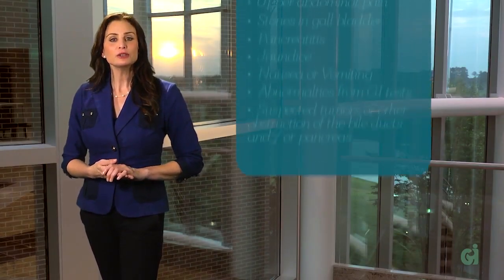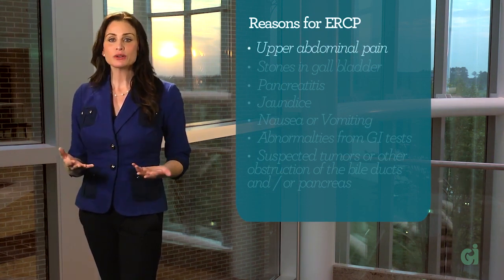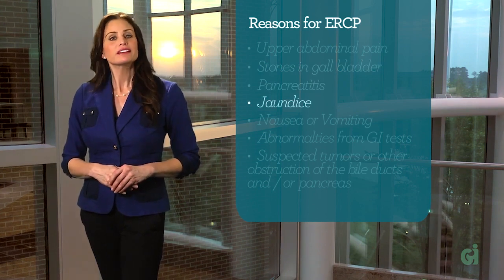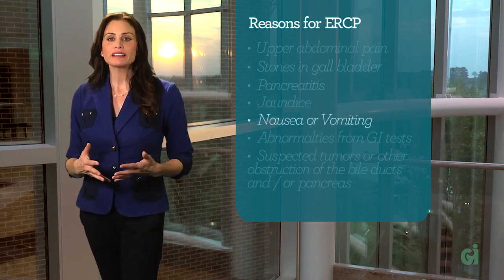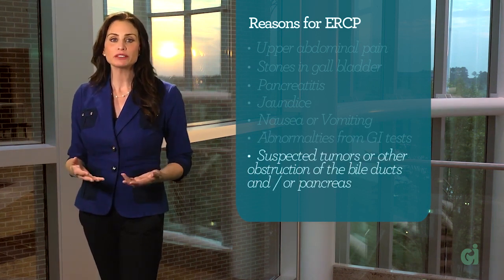The most common reasons for ERCP include, but are not limited to, unexplained upper abdominal pain, stones in the gallbladder or bile duct, pancreatitis, jaundice, nausea or vomiting, abnormalities from other GI tests, suspected tumors or other obstructions of the bile ducts and/or pancreas. ERCP rarely causes discomfort.